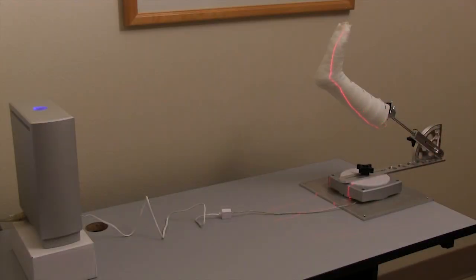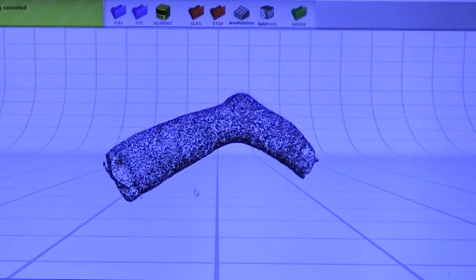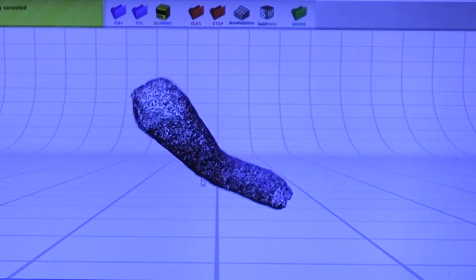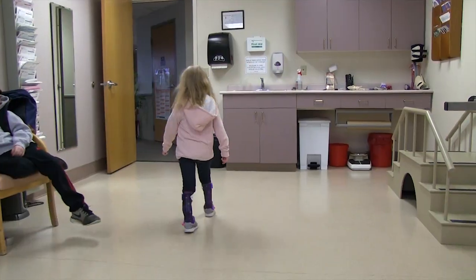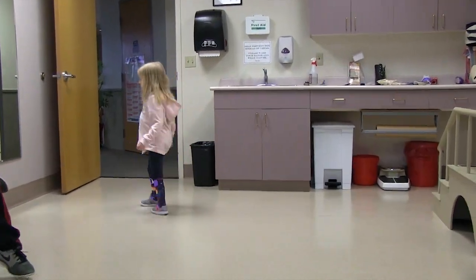Measuring cast thickness accurately is an important part of scanning. This allows us to accommodate for the overall volume so that we can make an accurate model that represents the patient's foot and ultimately a well-fitting brace. So let's get started.